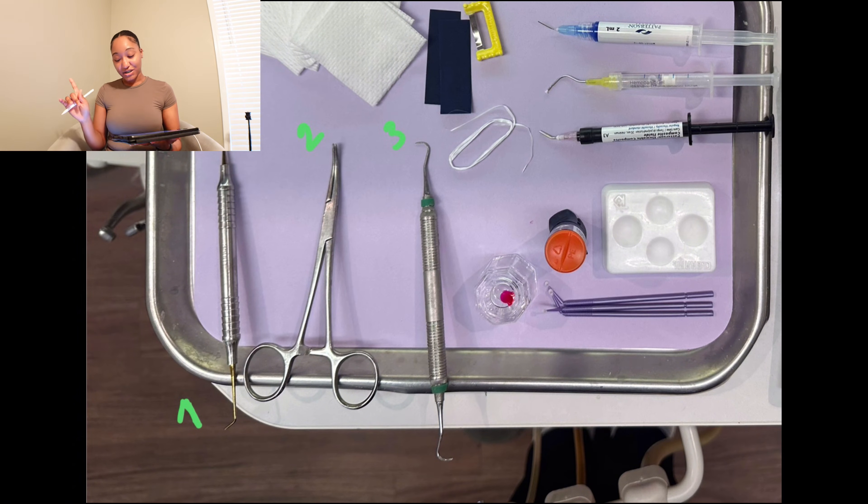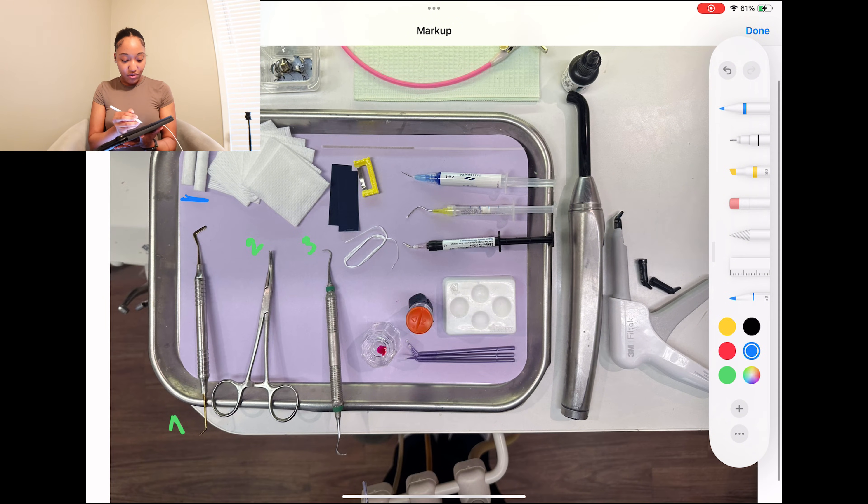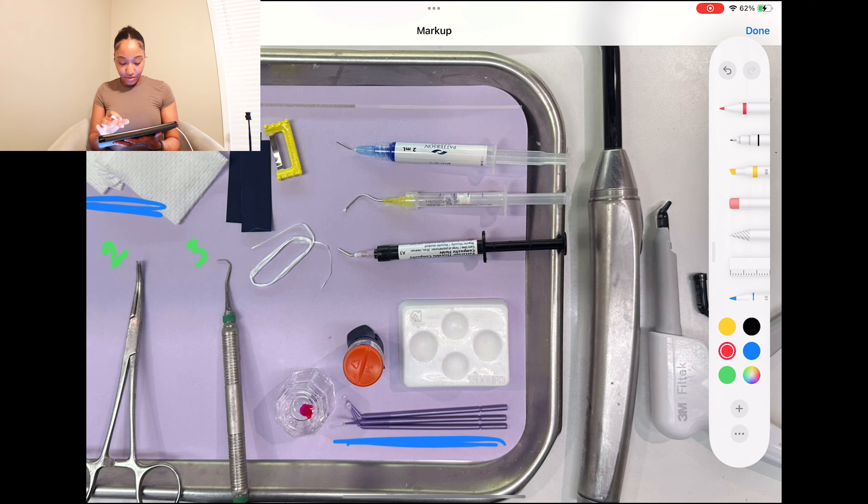Now let's talk about drying. A big thing to focus on when doing composite procedures is that composites work best when the tooth and surrounding areas are dry. I know that sounds crazy because we're working in the mouth, but you're going to want to make sure you have cotton rolls out, your two-by-two gauze, and also micro brushes, which can be used to dry or tap away blood. Make sure you have your drying tools out — that's going to be key to the process.